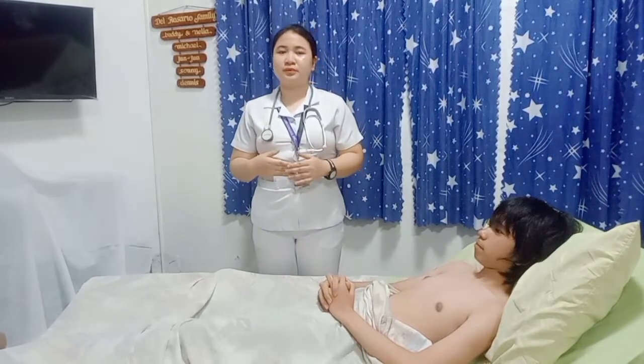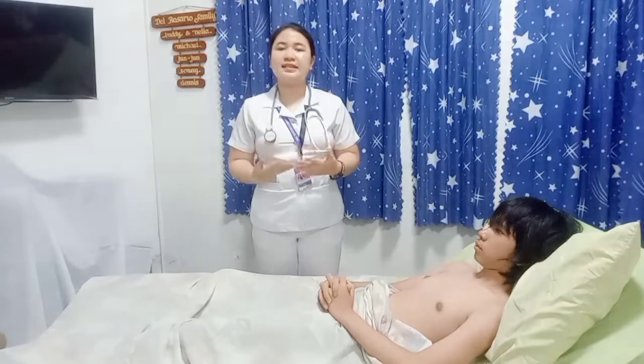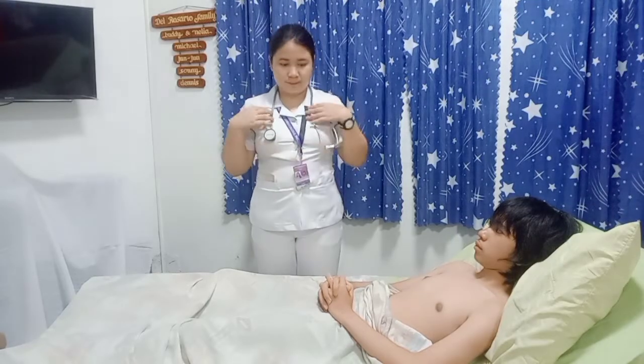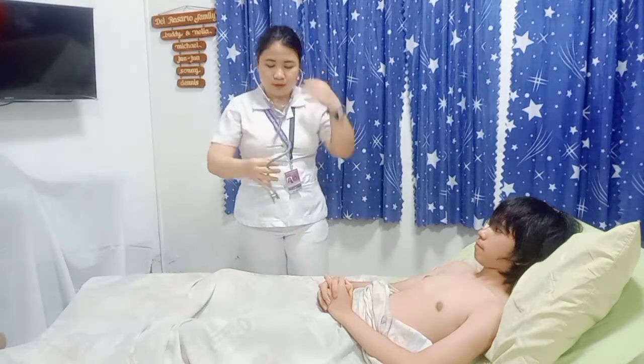Okay, so now, I will auscultate for the heart rate and rhythm. So by doing that, place the diaphragm of the stethoscope at the apex of the heart, here at the left fifth intercostal space mid-clavicularly, then listen to the rate and rhythm of the apical impulse. Count the heartbeat for a full minute. Okay, so I am going to auscultate now your apical impulse.